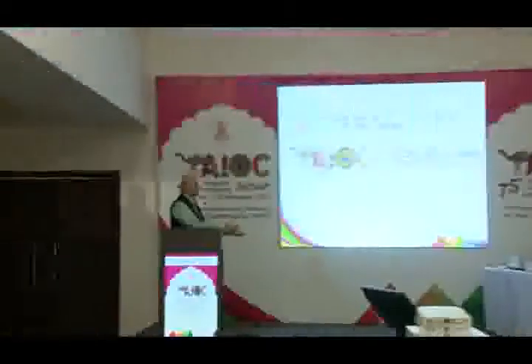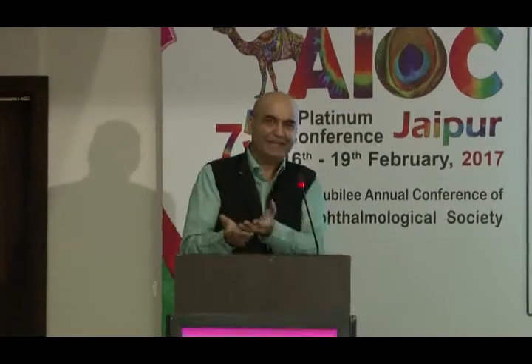Yeah, please. Can you come here? How do you calculate the power of the phakic lens accurately? The power is the refraction of the patient. That's the best part. You can go wrong when you're doing a Prelex. You can go wrong because of biometry, which formula do you use? Sometimes you are stuck at 21.98. Whether you go Haigis, you go Hoffer Q, you go SRK/T, you don't know. Some patients do well with Haigis, somebody will do well with the Hoffer Q. Here you're just targeting the refraction. You don't need to do anything. There's no formula there. That's another plus point. You're actually saying what I said in that debate. It is a refraction, always a refraction.